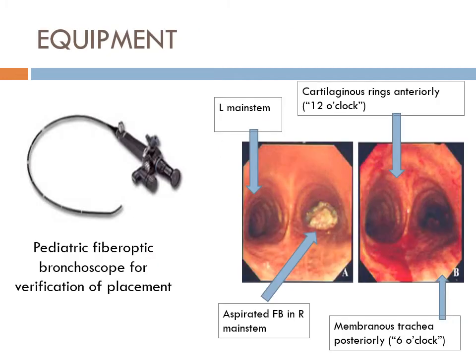So we also need a fiber optic scope. This is a pediatric fiber optic scope. That's not a video. This is you literally looking in this little glass thing, and you're watching, you're manipulating. No one else knows what you're doing.